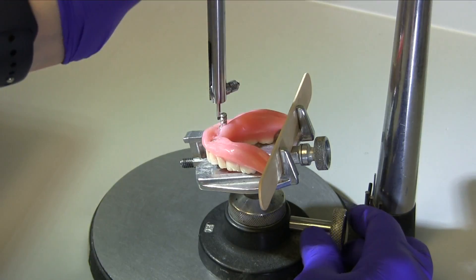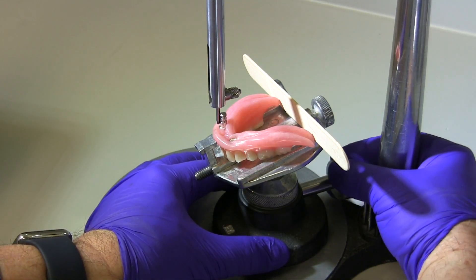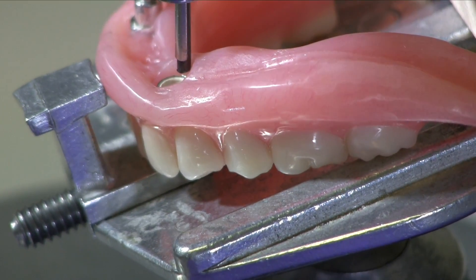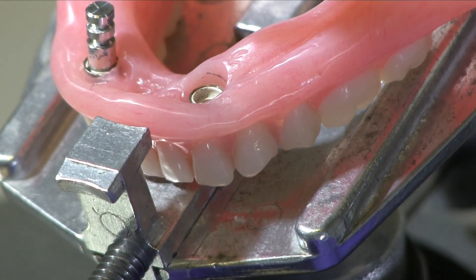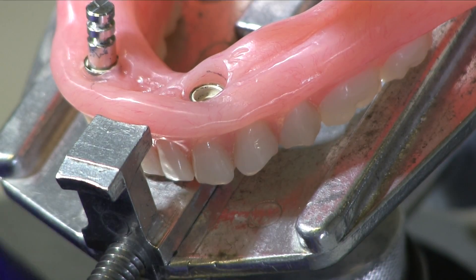Use an analyzing rod or carbon marker to parallel the replica. Tighten the ball joint of the cast holder. Use a carbon marker to mark the height of contour on the internal surface of the acrylic surrounding the abutment housing of the other implant locations. Identify areas where the height of contour indicates an undercut.